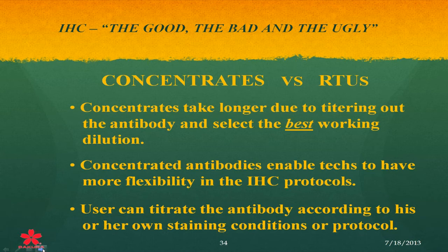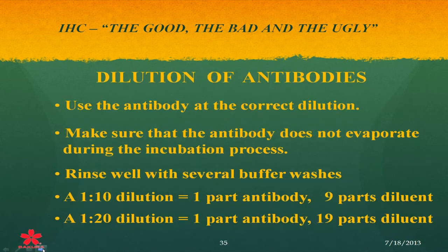Concentrates versus ready to use. Concentrates take longer due to titrating out the antibody and selecting the best working dilution. Concentrated antibodies enable techs to have more flexibility in the IHC protocols. The user can titrate the antibody according to his or her own staining conditions or protocol.